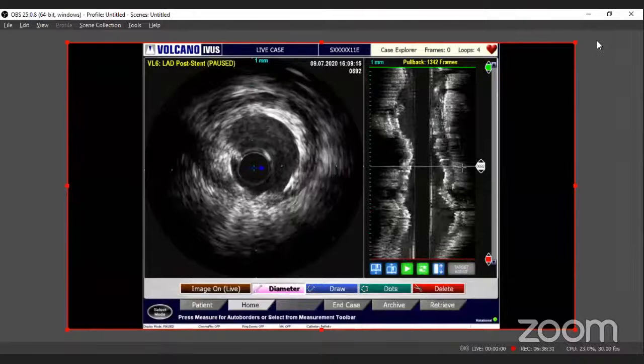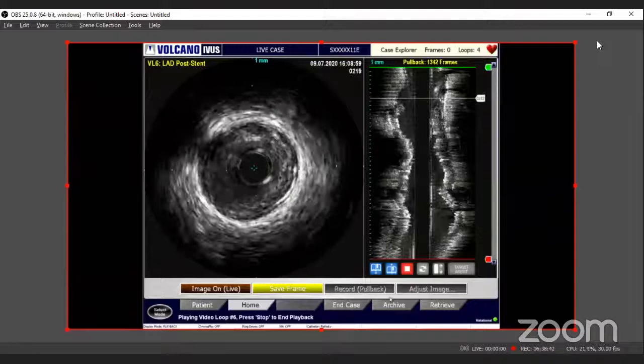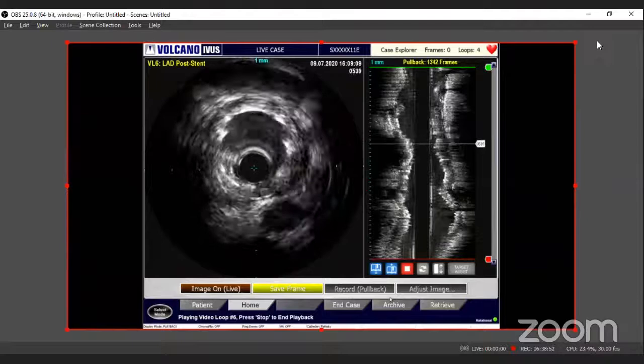So this is the mid-LAD distal to the stent edge. On angio, it looked not too bad. On IVUS, as usual, we see a bit more plaque than we realize on angio. This is the diagonal. So the distal stent edge will come up here. Post-PCI, we want to know whether there are any stent edge complications. So that distal stent edge looked okay.